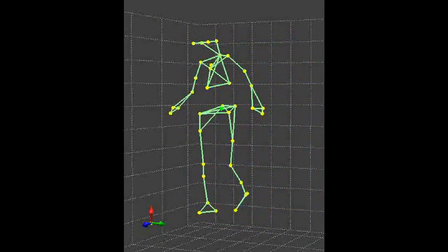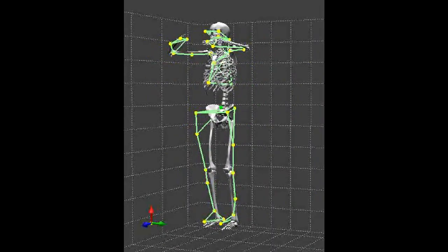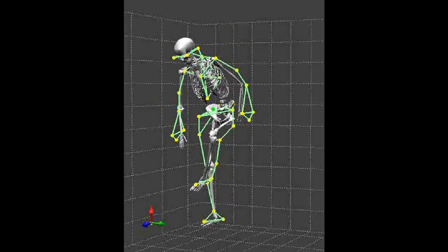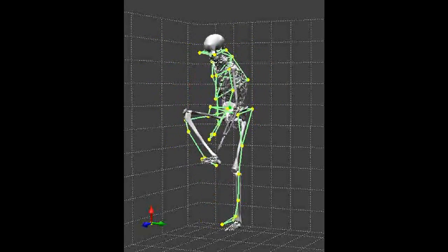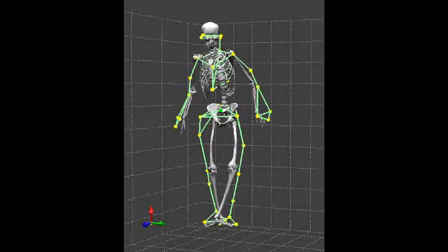Those markers are shown in this animation as little yellow dots that are being connected by green lines. If we know where those markers are, we can then hang a skeleton effectively in between those markers and make the skeleton move as the markers move.